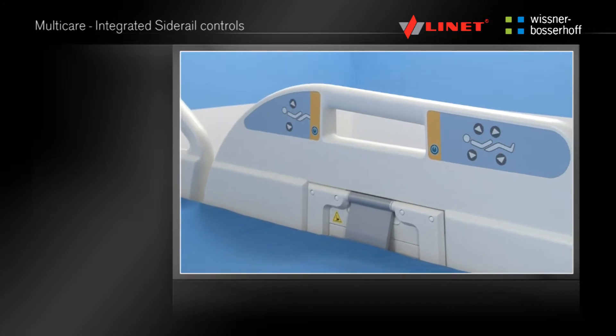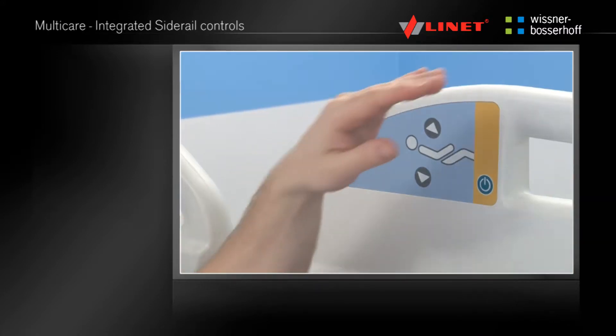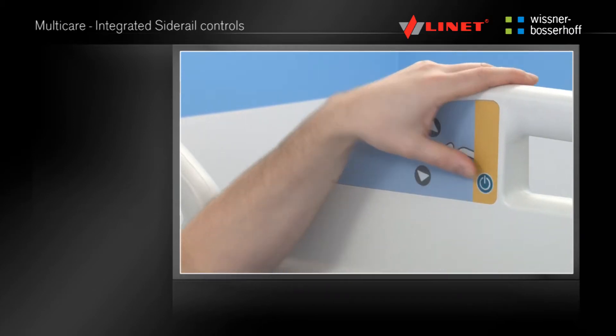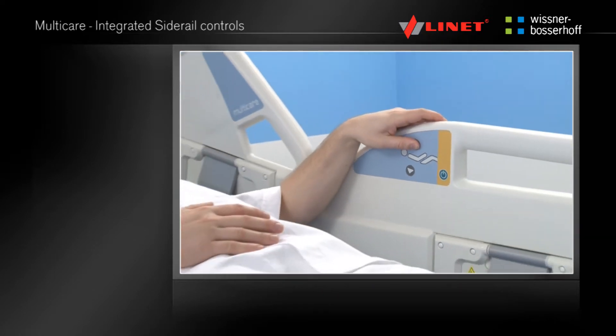The controls in the head side rails will raise the backrest and height adjustment, while the controls near the patient's legs will adjust the thighs and knees, either separately or together — auto-contour.